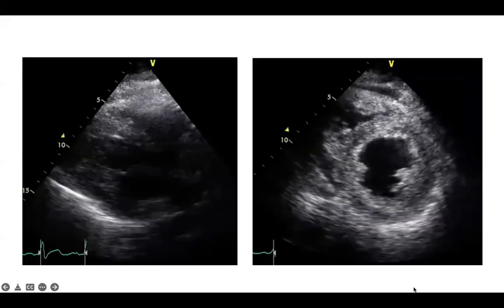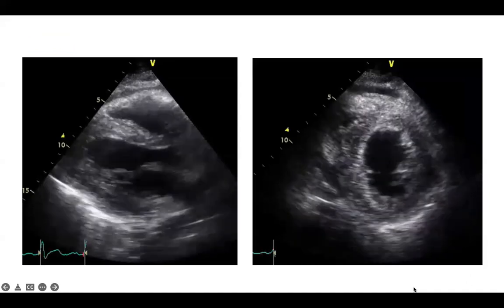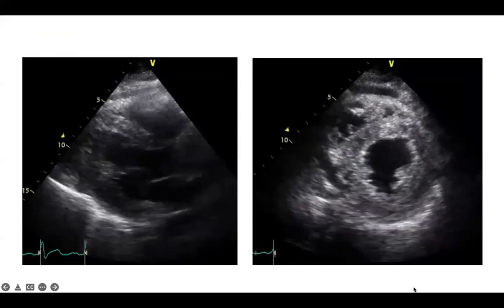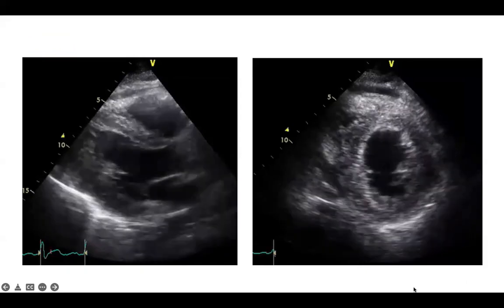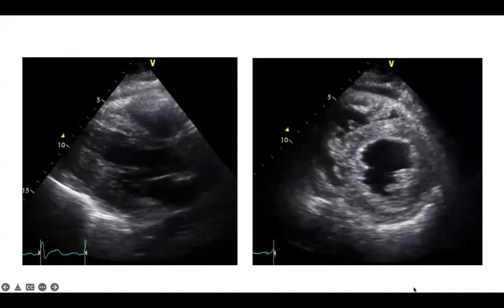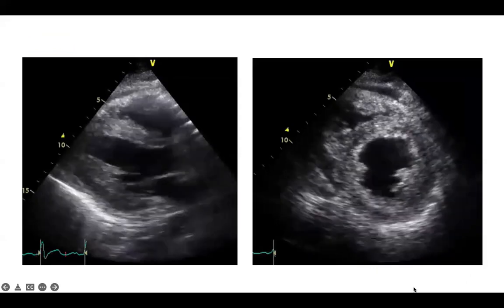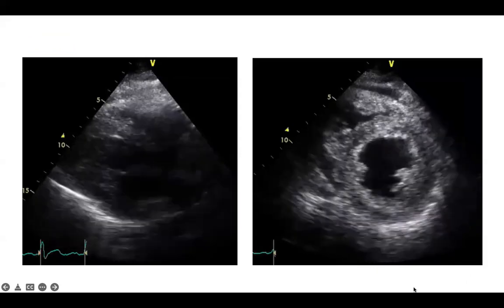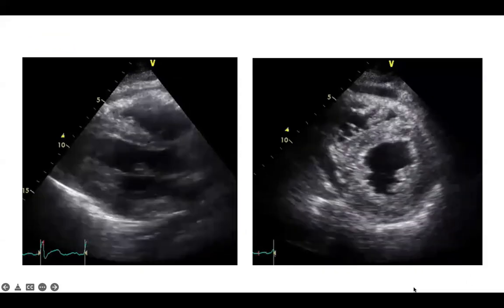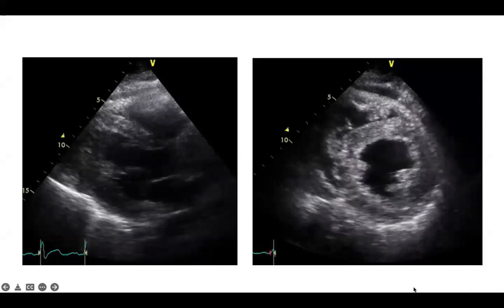وعشان نأكد الassessment of systolic function, عملنا other views, عندك long axis on your left hand side, short axis on your right hand side. طبعا both of them confirm the presence of significant systolic dysfunction. But in critical care, we don't entirely trust ejection fraction as a marker for evaluation of shock, because ejection fraction itself is a number that is affected by various factors. Ejection fraction is dependent on preload, on afterload, on heart rate, on geometric assumptions, and you will not find ejection fraction in any of the definitions of shock.